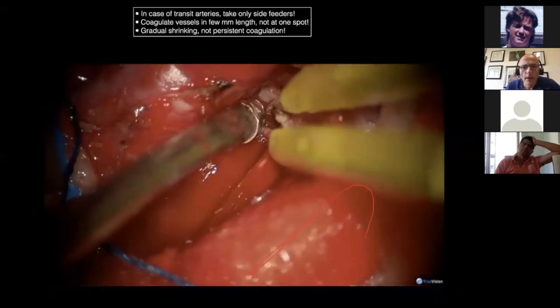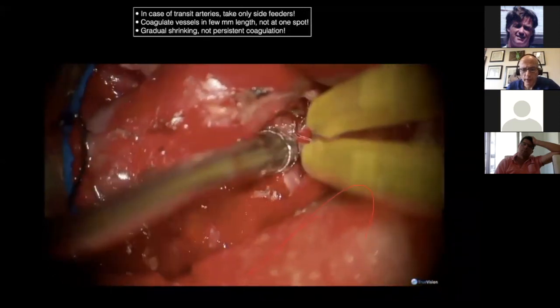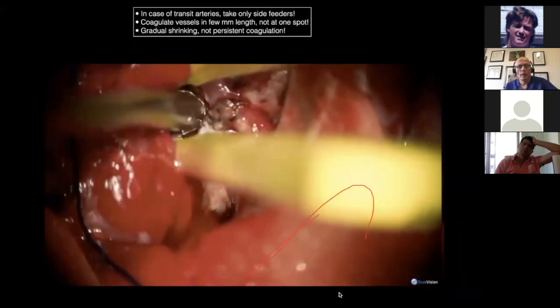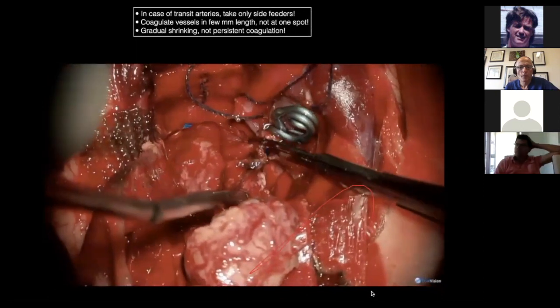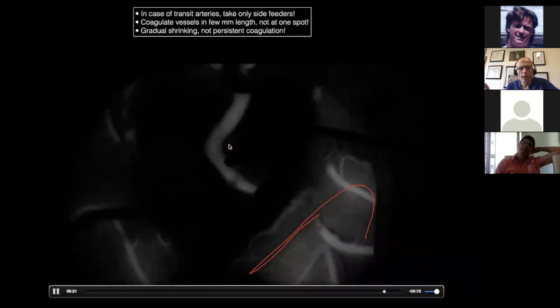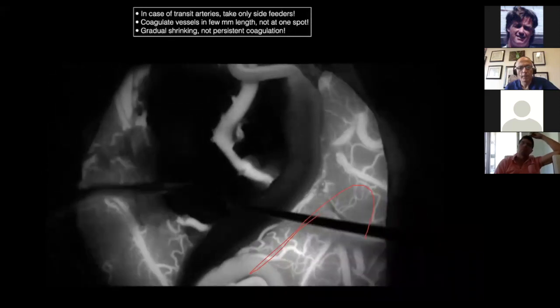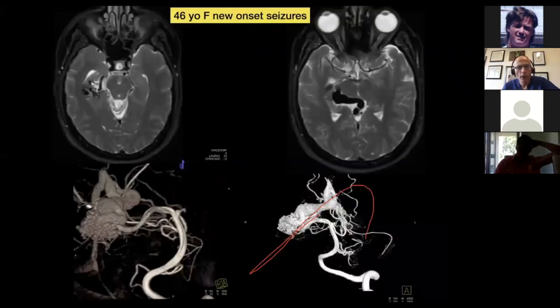Constantly inspect. Constantly. Am I missing anything? Dissect, make sure, and then leave that part, move to another part. See, here I'll do hemostasis and wait for 10, 15 or 20 minutes. I did ICG green. And it looks good. The vein is thrombosed. You are doing fine. When he woke up, he was moderately receptive aphasic and improved over several days and is completely normal now. And he's cured.